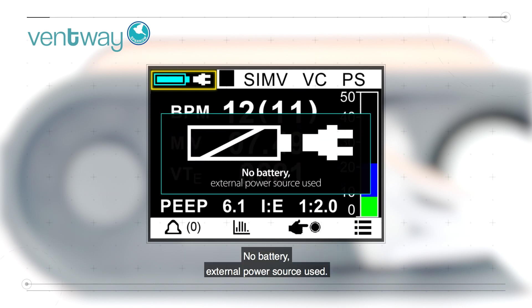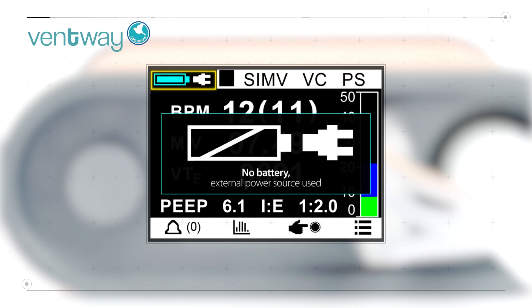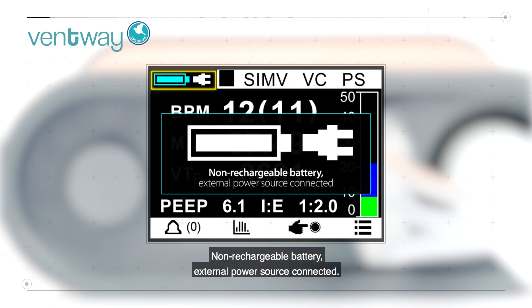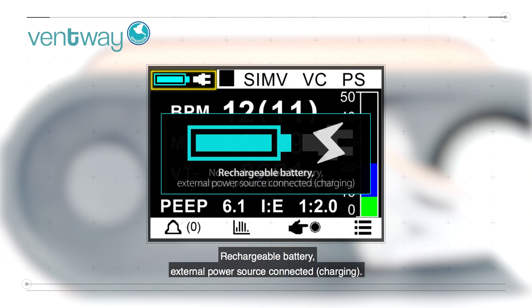No battery, external power source used. Non-rechargeable battery, no external power source. Non-rechargeable battery, external power source connected. Rechargeable battery, external power source connected, charging.